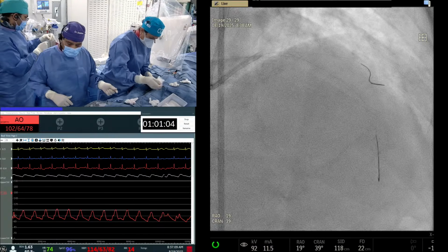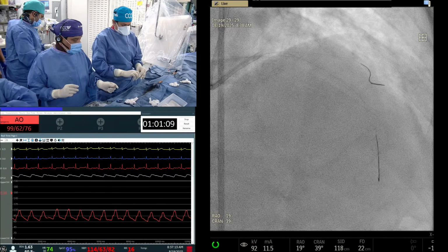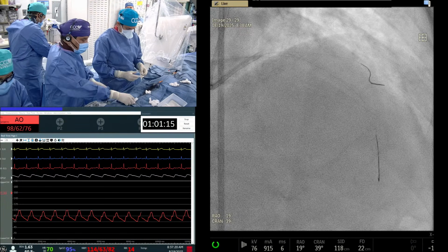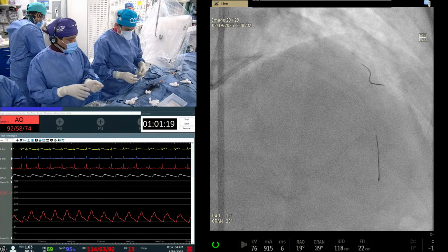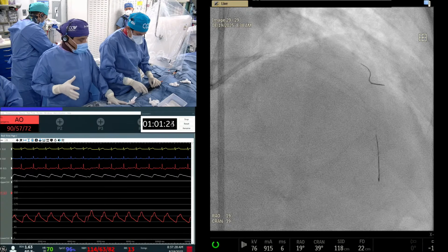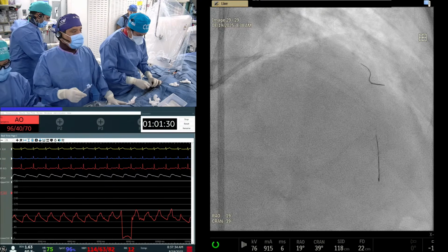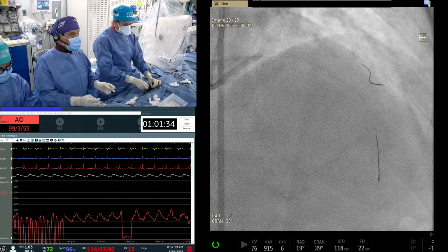This is the classical case where you're going to need 2 stents because long lesion, a little angulated, some calcium, vessel size less than 2.5, and lesion stenosis more than 80. So everything was there. This is not what we call a bailout. This is a planned 2 stent approach. So we wanted to just do this DCB strategy in this case. If not the DCB, this case is clear cut, a planned 2 stent approach.